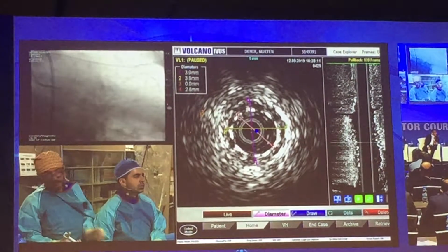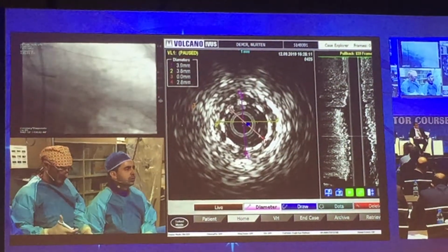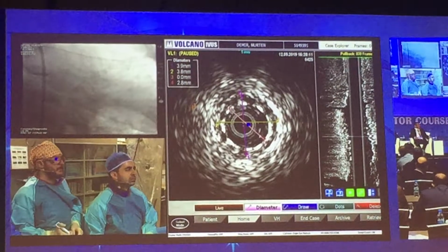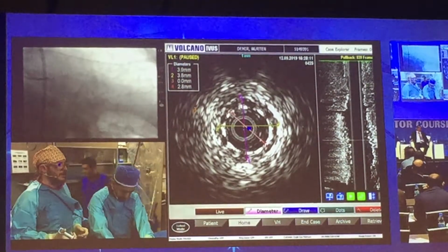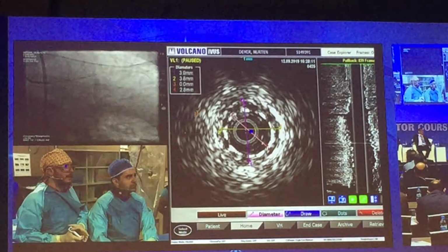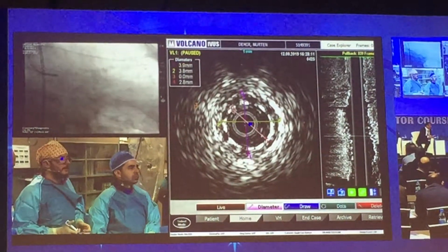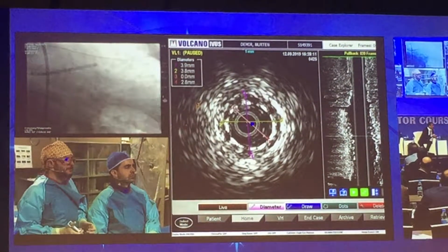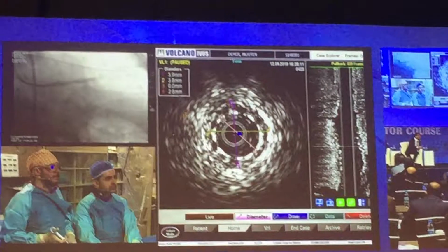Do you think that BioFreedom is a suitable stent for the in-stent restenosis? Okay, again contrast. The issue is not my agreement. The operators agree with this. We asked this question in terms of radial force or something? In terms of the durability of the polymer to maintain this stent open and prevent the risk. Okay, enough.